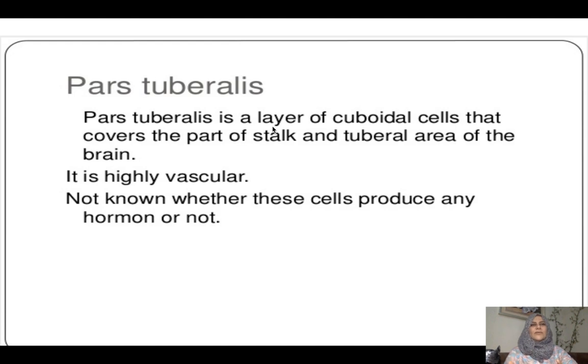نيجي على البارس tuberalis. أنا هسه لما شرحت pars distalis and pars nervosa، قلنا هذه anterior هذه posterior، بالنص صارت عندنا البارس intermedia. حتى تندل وين البارس tuberalis، it is as a sleeve which surrounds the pituitary stalk. يعني احنا مو نعرف كنا البيتيوتري جلاند عنده pituitary stalk، فكأنما مثل الردن اللي راح يكون محاط بالبيتيوتري stalk. pars tuberalis طبعا except the posterior region there is no pars tuberalis.